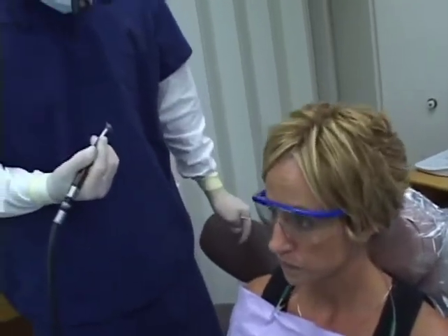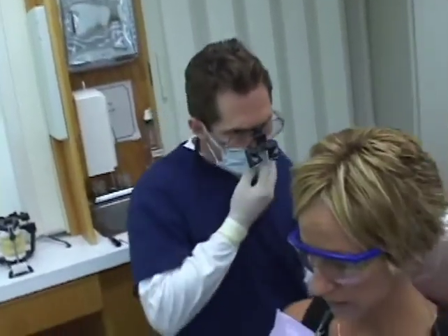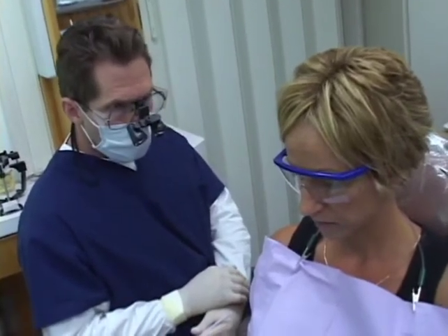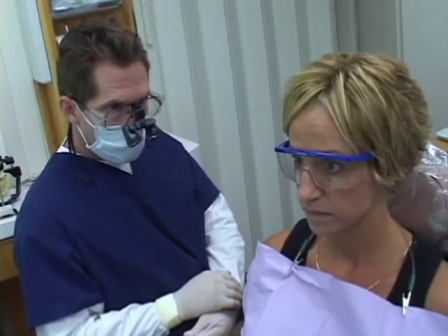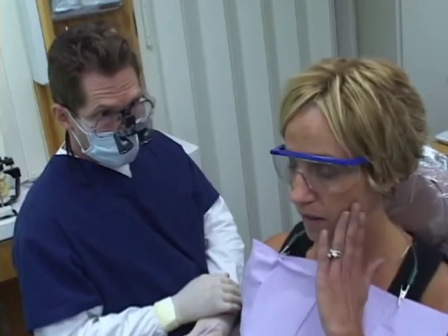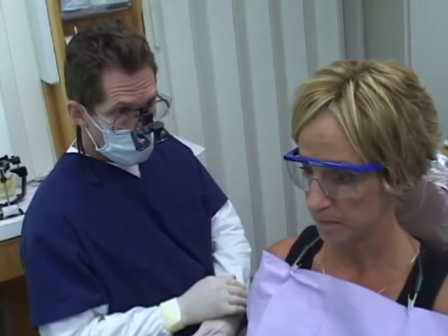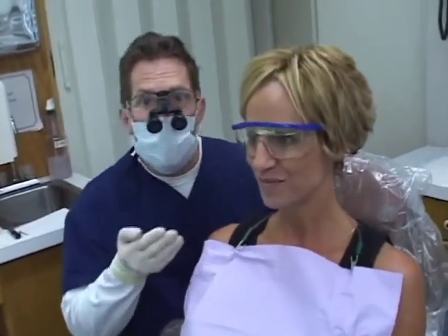Based upon what you're feeling, let's just let this go and see how it feels. Now Debbie, just tap your teeth lightly together and squeeze real firmly. Do you have any awareness of any tooth in your mouth at all? It may feel like one tooth is hitting heavier than the others. - I think on my left side, maybe just one heavy spot. Can you tell about where it is? - Maybe 14 or 13. By the way, Debbie is an assistant, so that's why she knows these tooth numbers.